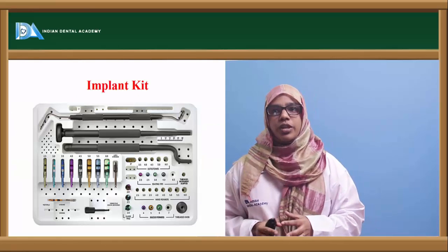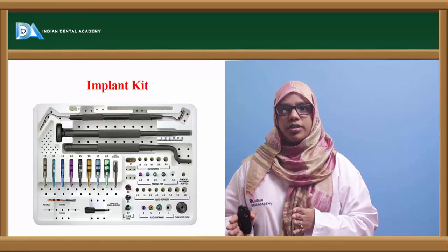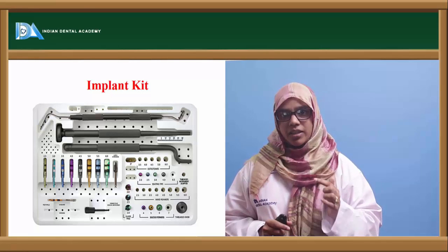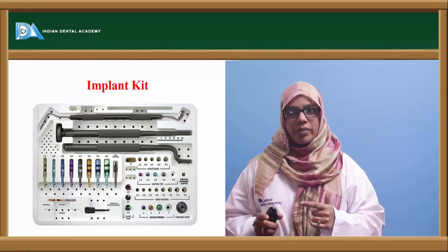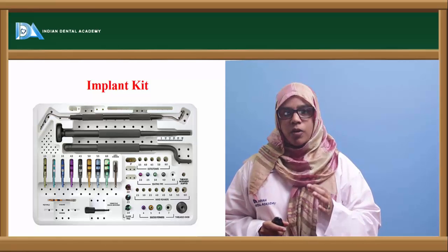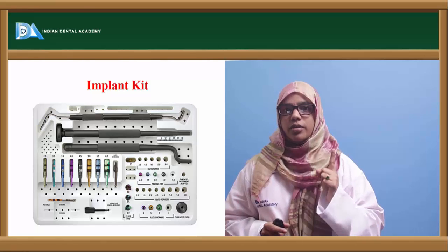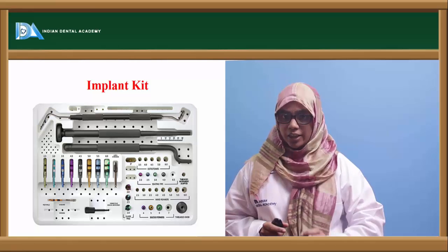Now this slide shows an implant kit wherein a number of color-coded drills are present. On the drills there are markings that will determine the length that you have to go inside. Before these drills there is one black pilot drill, which is used to create your purchase point and remove the cortical bone. Once you have used the pilot drill, you have your first pointed drill. With your first pointed drill, you will get the length of the implant.